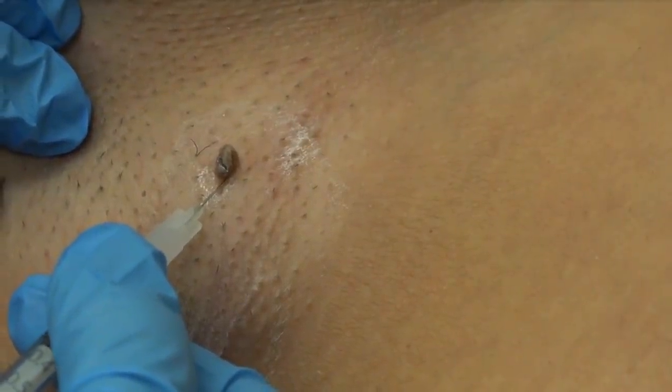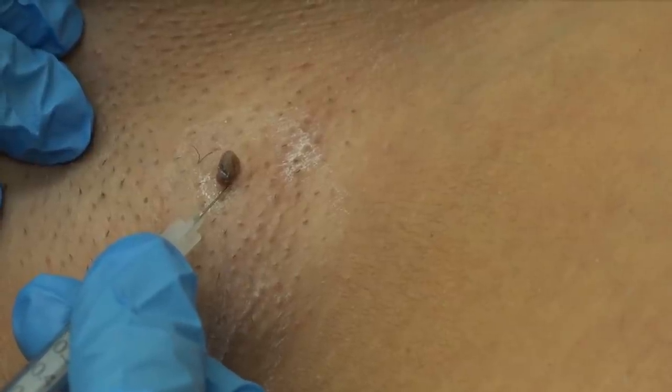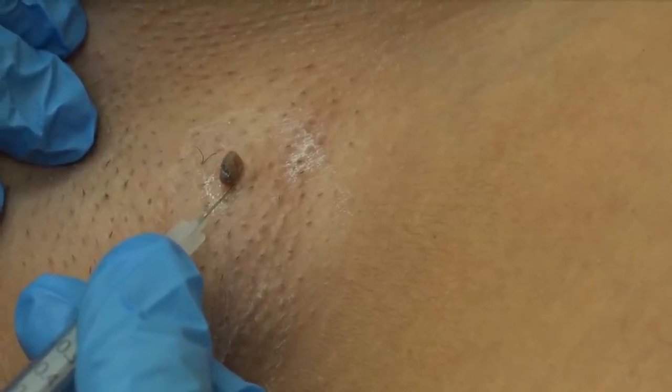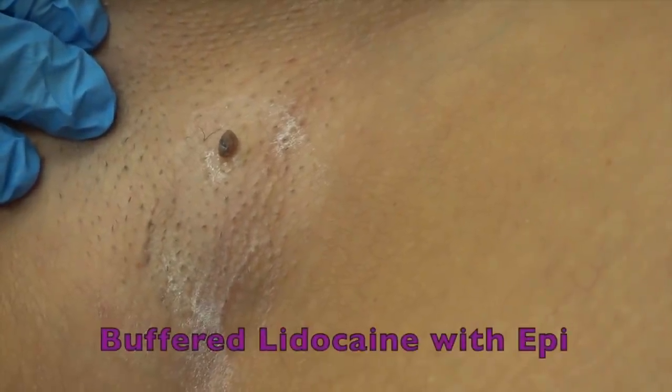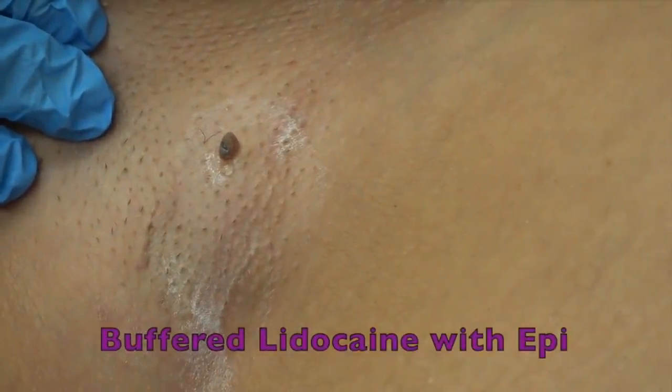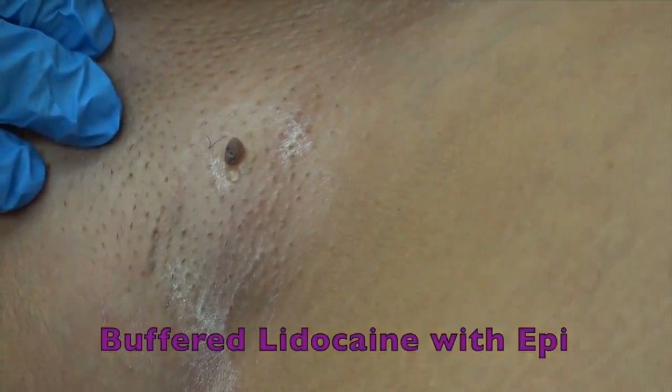Yes, are we all ready? Okay, stop. Yep, that is cold spray. Give her a little shot. Here we go. Stick, sting and they burn. Dr. Gilmore says stick, sting and it burn. No, Gonzo says stick, sting and it burn. You're the doctor right now, I'm the assistant this time. Did you squirt it all in? Yep. Well then you can withdraw the needle. How was that? Did that hurt much? No. Was the cold spray cold? No. It was cold on my hand. She's just being obstinate.